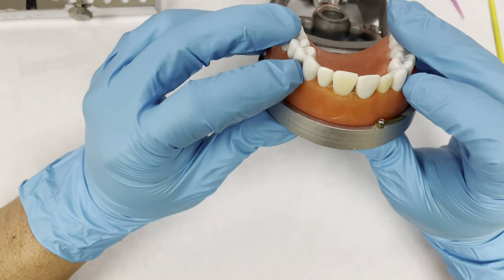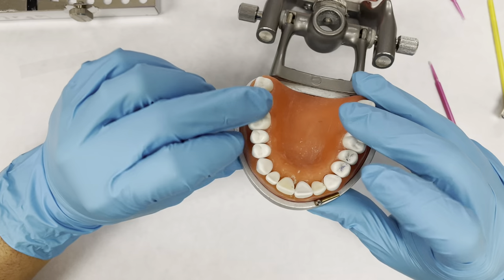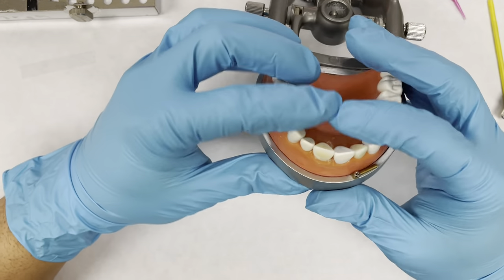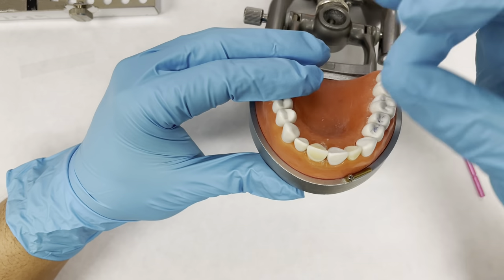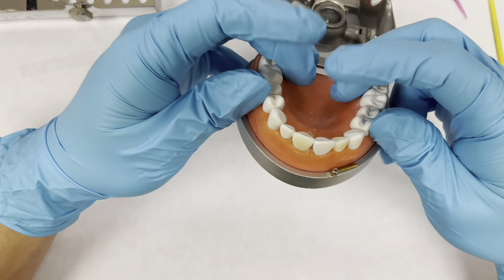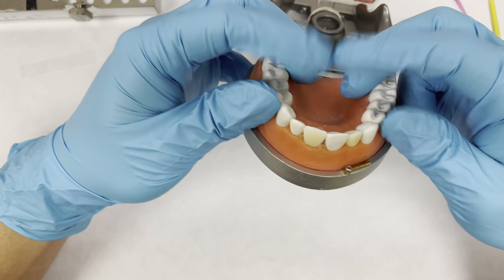For the anteriors, I basically just went from premolar to premolar and put clamps on both sides. It's unnecessary, but I just liked having the extra space to work so I didn't have to push my mirror against everything. It just kind of had its own little space from the clamps.